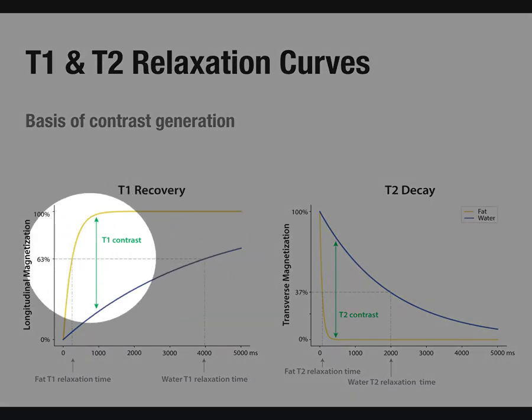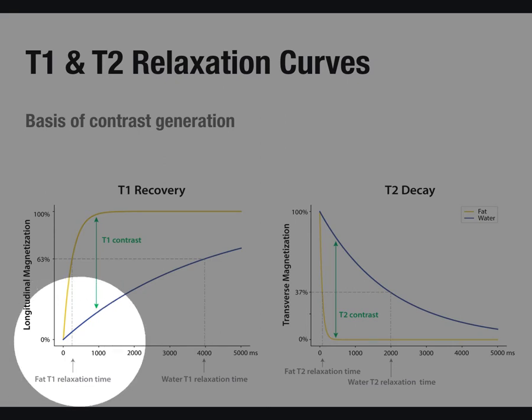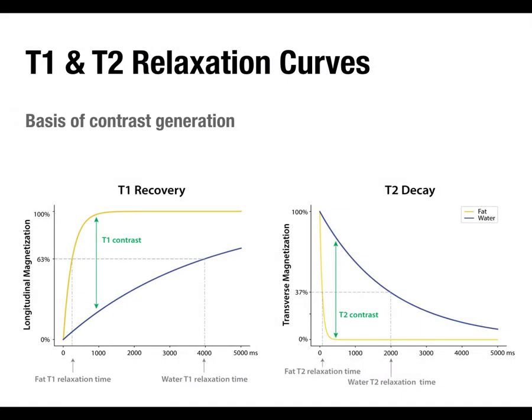So the whole goal of designing an MRI pulse sequence for structural MRI, we'll come to fMRI next week, is to maximize the contrast between those two tissues. So what this is telling us is, okay, time zero here is when we turn that RF pulse off. So we send in some energy, we turn it off, these things start happening. We want to record the signal, so we don't record from that receiver coil all the time.